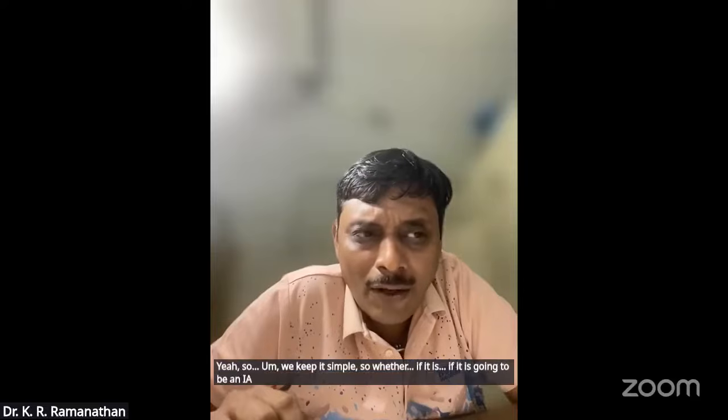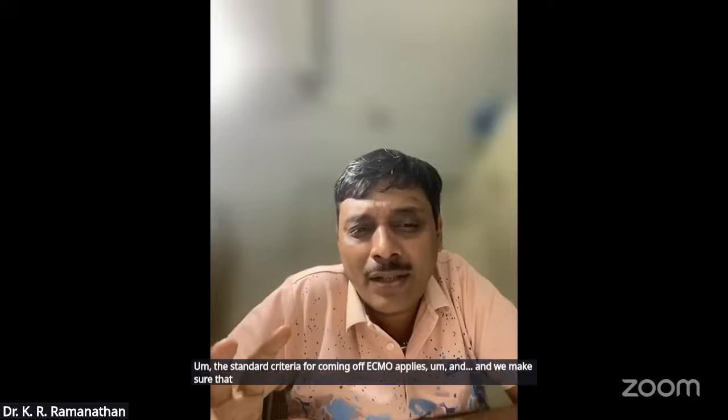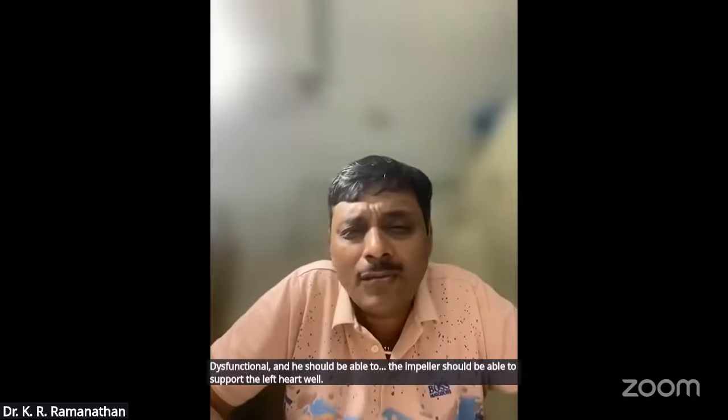Yeah. So we keep it simple. Whether it is going to be IABP or Impella that's being used for unloading, we just keep those devices in situ and come off ECMO. The standard criteria for coming off ECMO applies. And we make sure that, if the patient is on an Impella, the right heart is not dysfunctional and the Impella should be able to support the left heart well. The same thing applies for IABP as well.